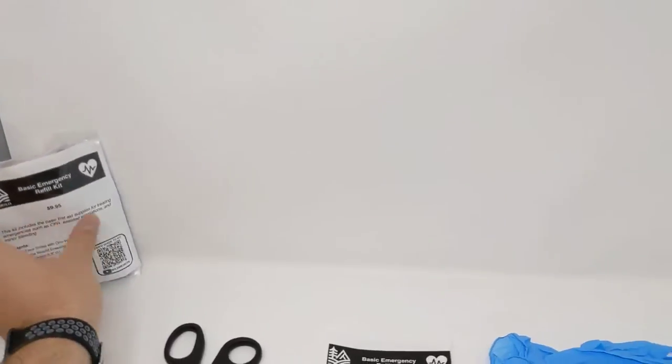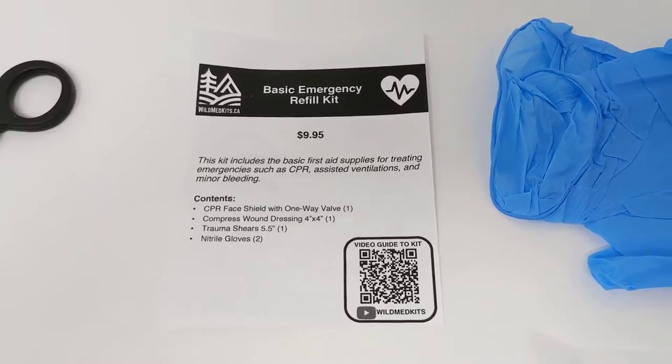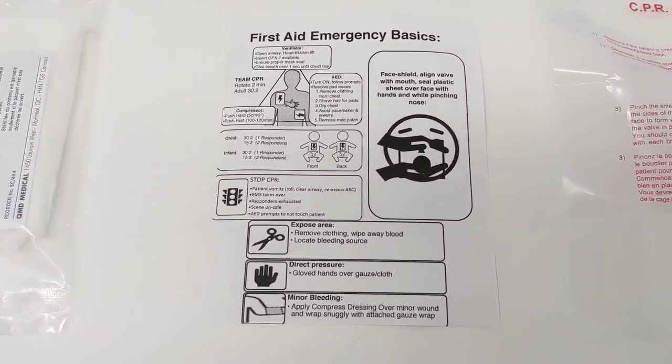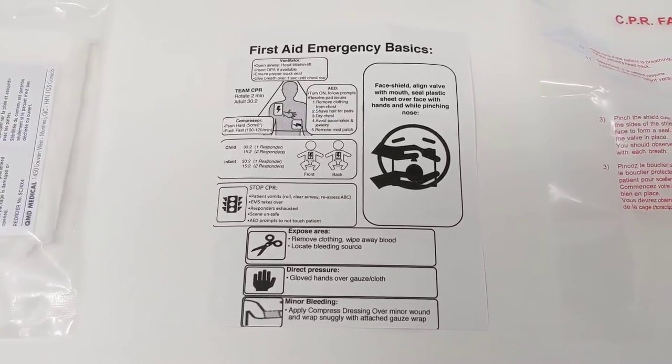It comes in a nice waterproof poly bag. It's going to have our contents card with our QR code that'll link to any relevant videos related to the content of the kit, as well as a quick user guide just to go over some of the uses of the contents of the kit.